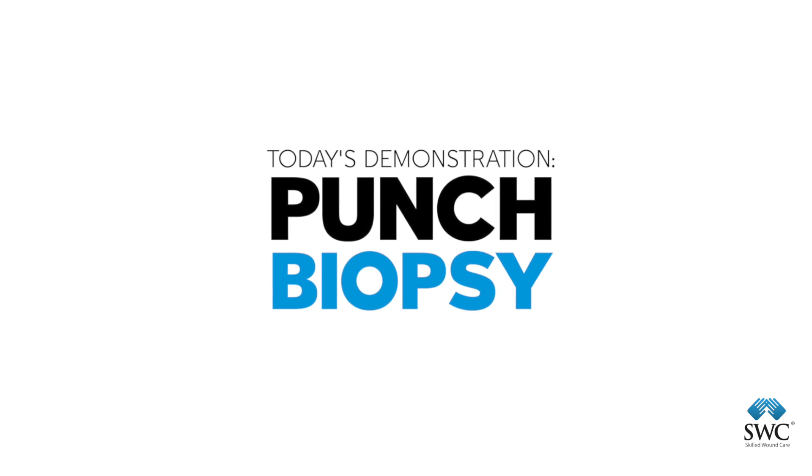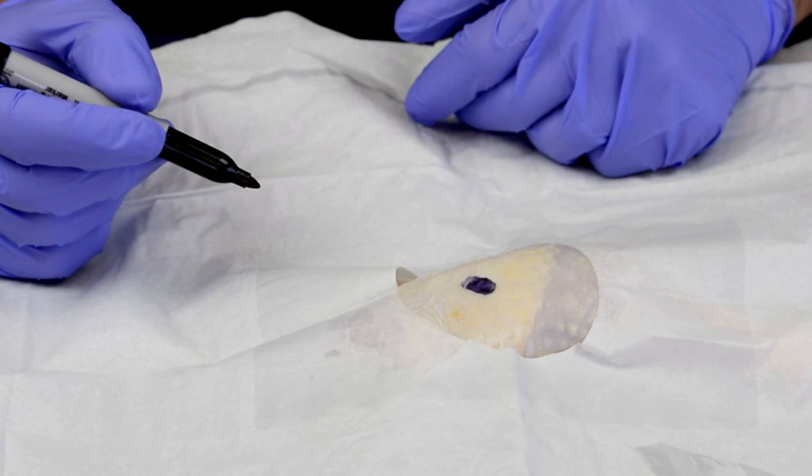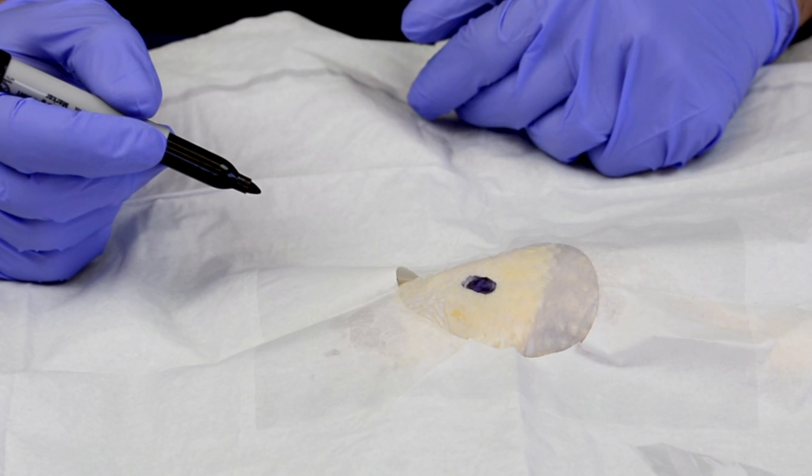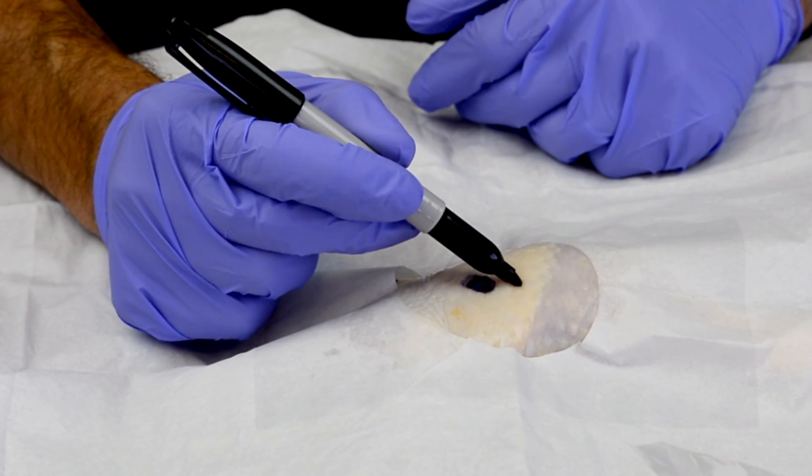We're going to be demonstrating a punch biopsy. The first thing you want to do is identify the lesion that is suspicious for cancer and outline it for the punch biopsy.